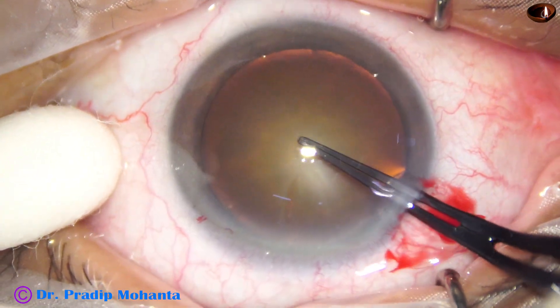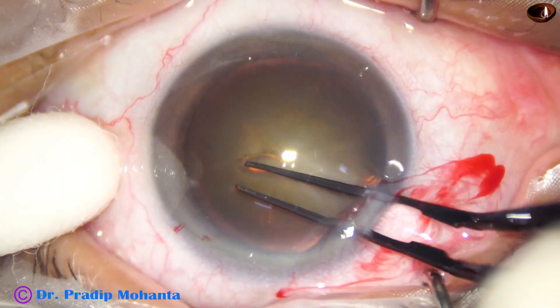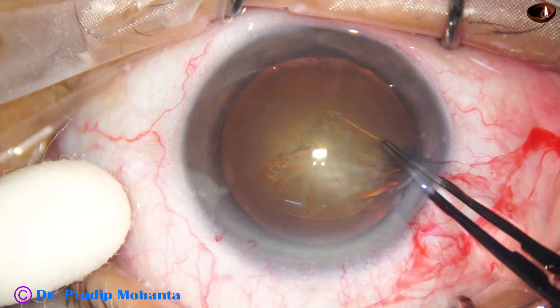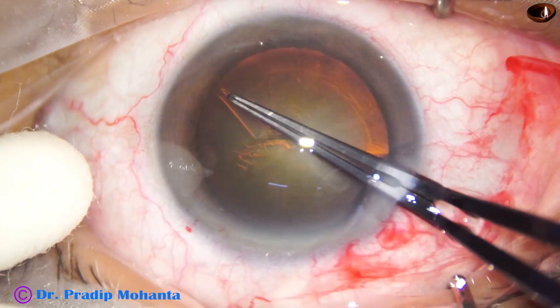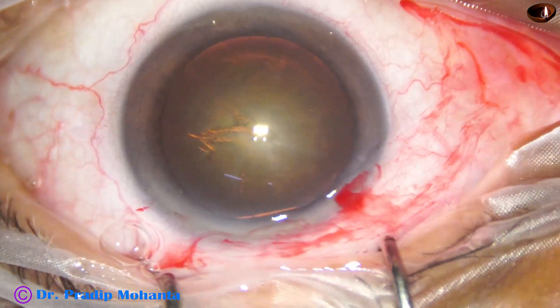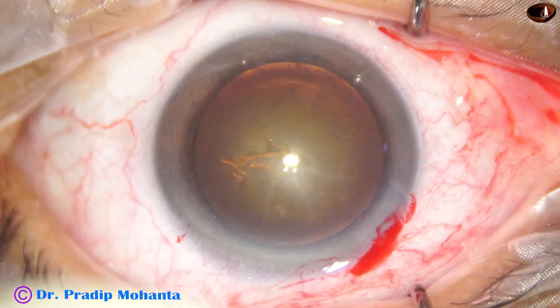Capsulorhexis is done with the help of the Utrata forceps. The Utrata pierces the center of the capsule and raises a capsular tag. This capsular tag is guided all around anti-clockwise to get an adequate sized capsulorhexis of 5.5 millimeters.